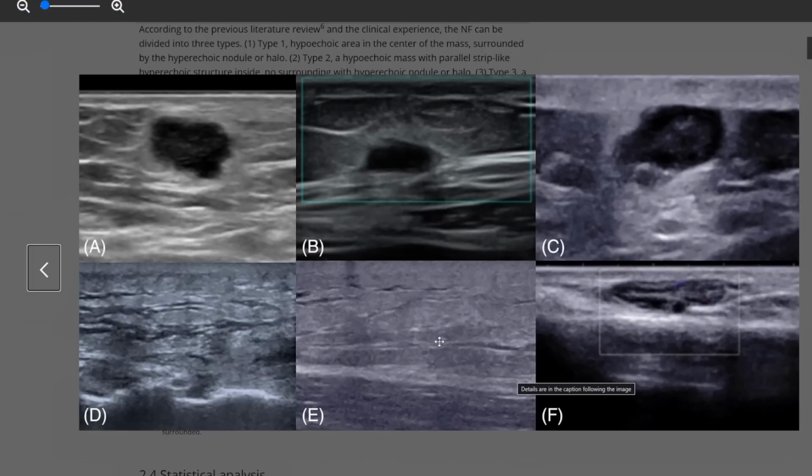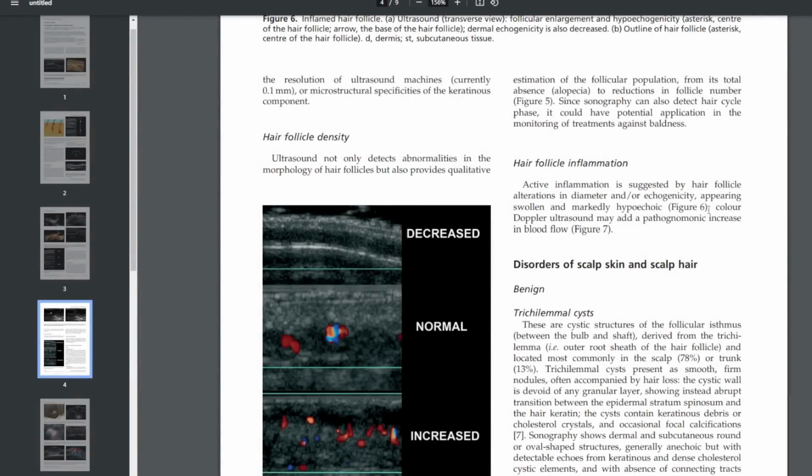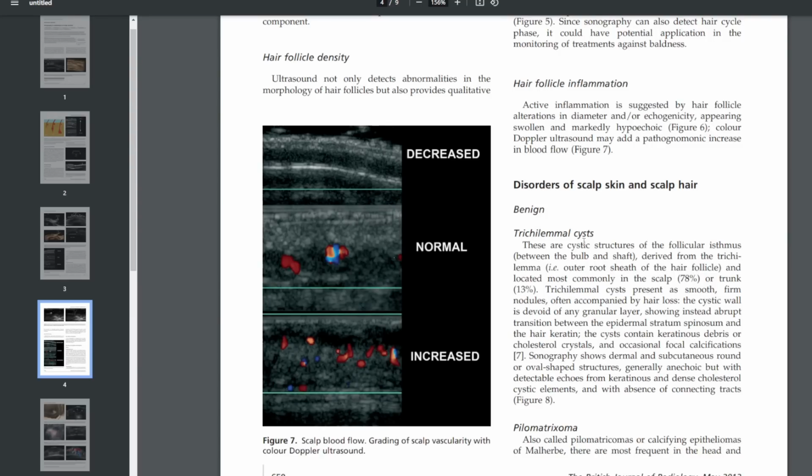story, right? So in my opinion, you have to first take into account the nature of the body part or organ or tissue, rather, that you're looking at. And then you have to take into account the hypoechoicity pattern that's being shown in the images. So that's pretty important.